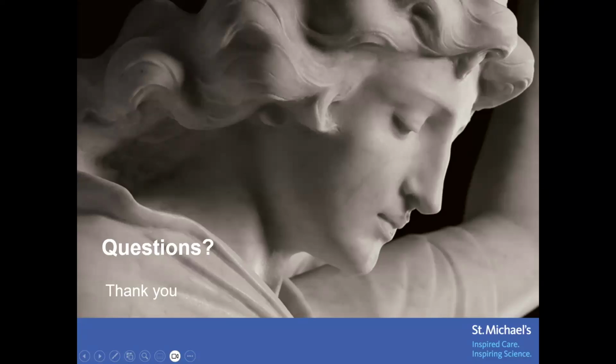So I mean, this prosthetic aortic valve usually is, to me, over the years, a mind-puzzling game. You end up having to put all these puzzle pieces together, in terms of the 2D findings and ejection fraction, stroke volume, and then you have to look at the Doppler findings, and then you do all the calculations, and then you have to integrate all those pieces together to actually figure it out.